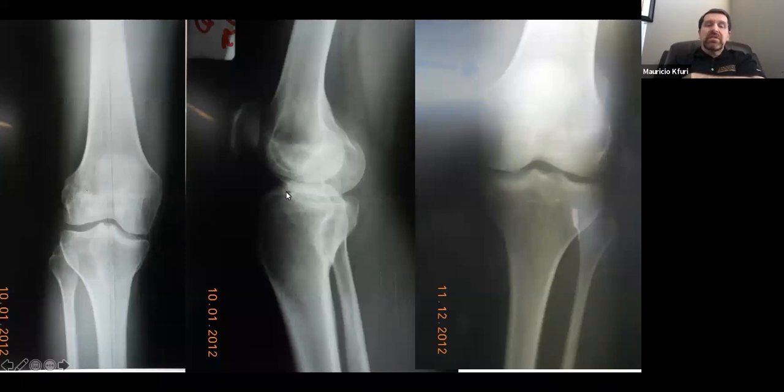And you see that there is a step off going to posterior medial. And if you do an osteotomy in a different plane than this one that you can see here, you may eventually improve the AP view of the X-ray, but you may not address completely the displacement of the posterior medial quadrant, meaning that you may get an improvement in the MPTA, but you may eventually continue to have a step off in the posterior aspect.